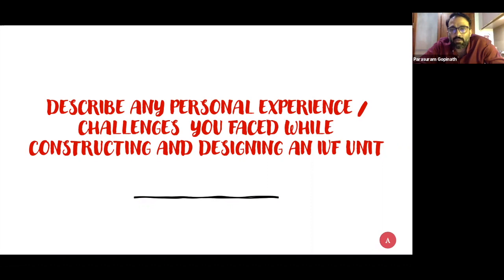Because a lot of times we always end up getting good quality embryos, but later on we realize that we don't have pregnancies, and there are early pregnancy losses. In the end of the day, that is when we realize that, unfortunately, we don't have an authority or a quality management system here which can actually assure us about the quality of things. So a lot of things like that, unfortunately, in India we don't get, so that we can rely on other things. If we are sure about what quality we're getting as far as gas is concerned, we can actually look at other issues that we are facing here. So that was one of the major extra things that we have very specifically in India.